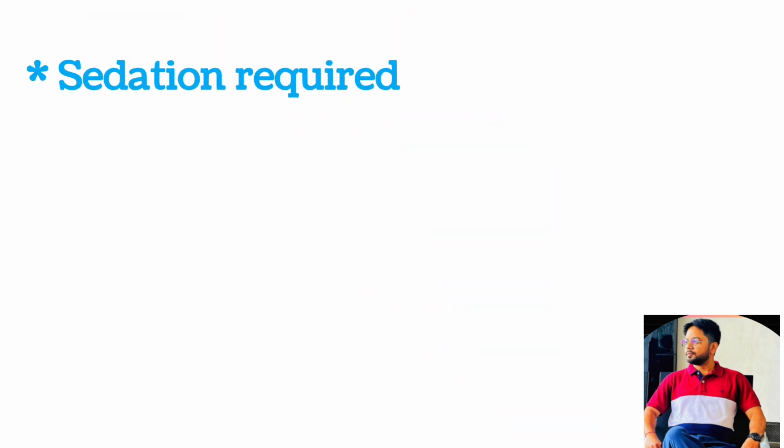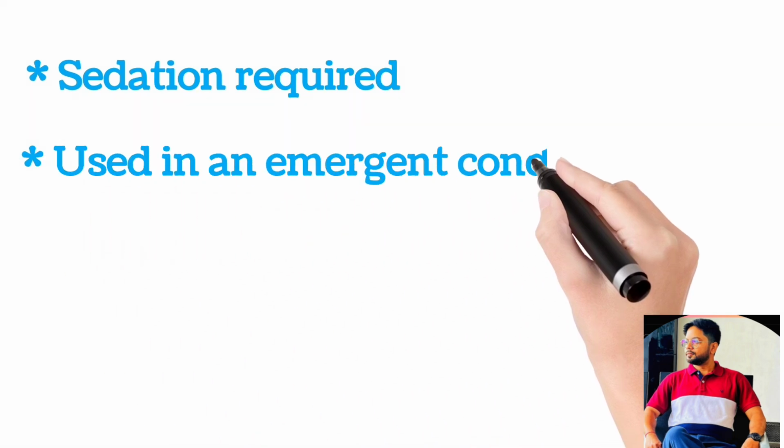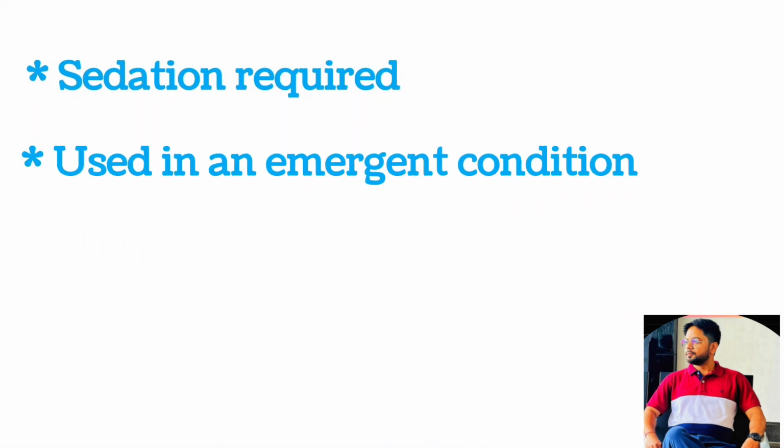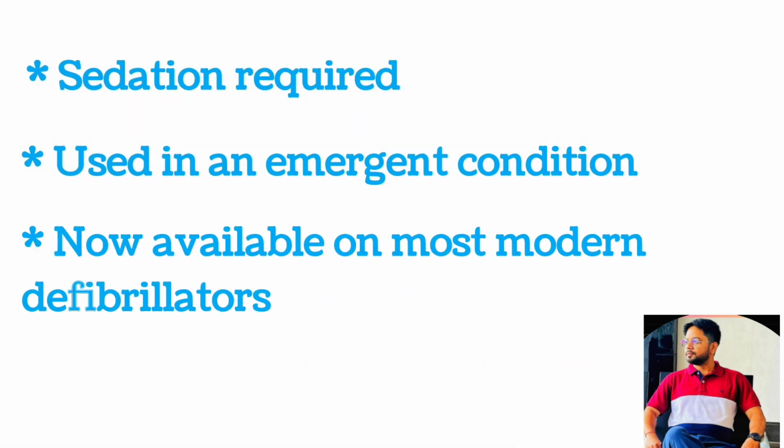Sedation may be required as this procedure is often uncomfortable to the patient. This technique is commonly used in emergent conditions until temporary transvenous pacing can be instituted. Transcutaneous pacing facility is now available on most modern defibrillators.